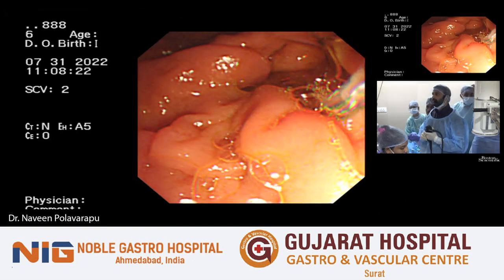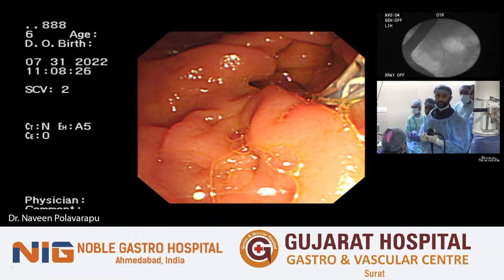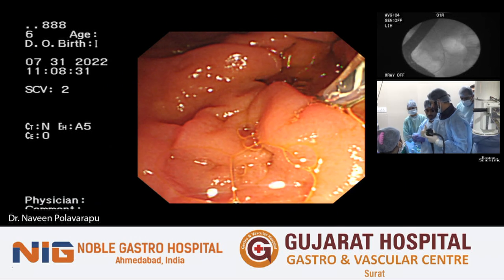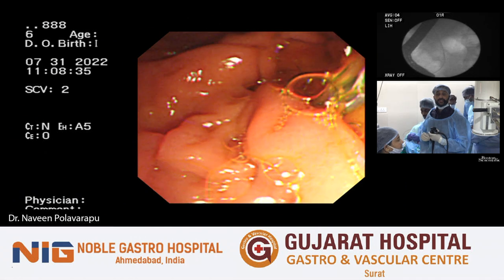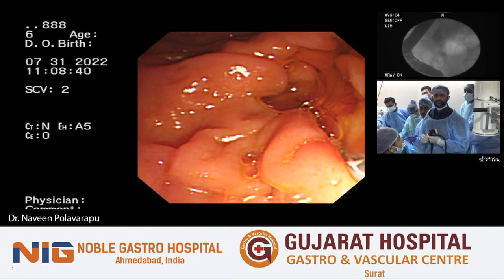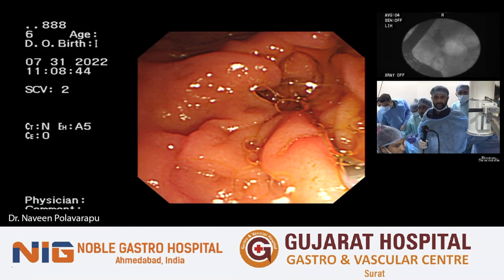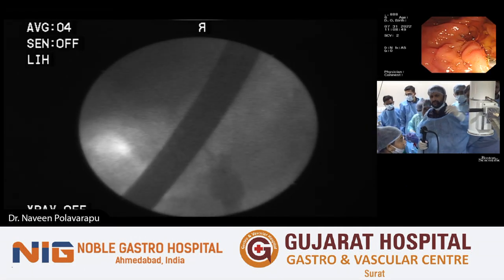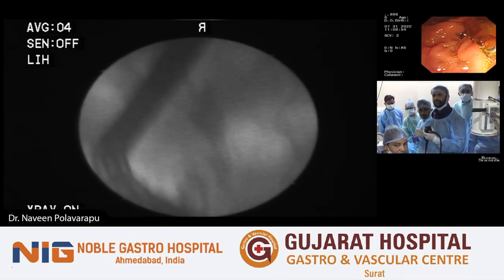So there is a question from the chat box, Dr. Srikant Gopi. Is sphincteroplasty necessary in all cases for sufficient ampullary opening for cholangioscopy, and in this case, is sphincteroplasty okay, because there is a CBD stricture at the lower end? Basically, sphincteroplasty in all cases, no. If the sphincterotomy is good enough, big enough, you don't need it.